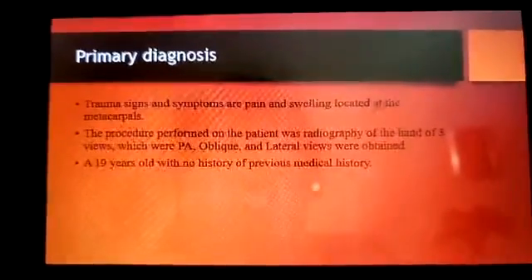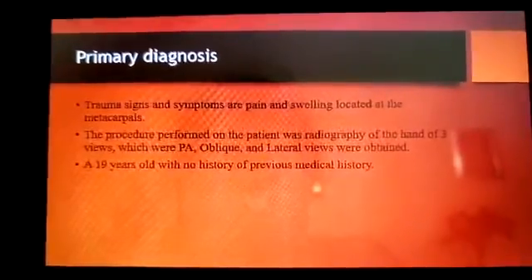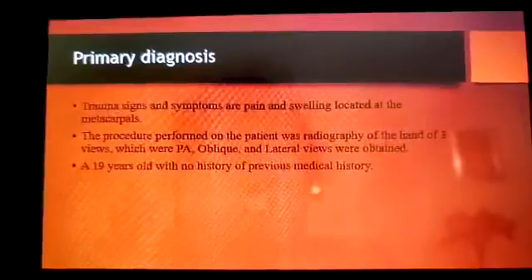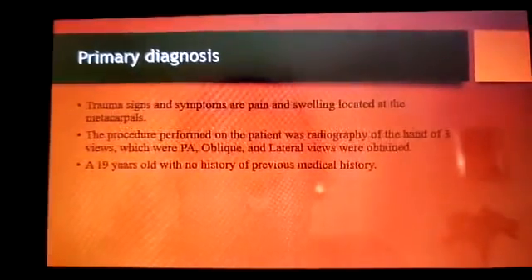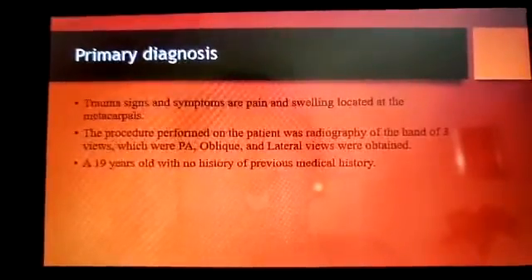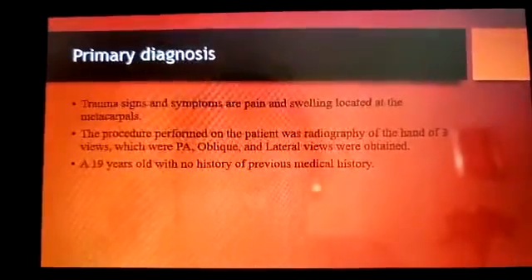The procedure performed on the patient was radiography of the hand of 3 views, which were PA, oblique, and lateral views. The patient was 19 years old with no previous medical history.